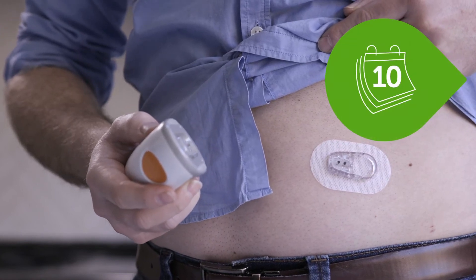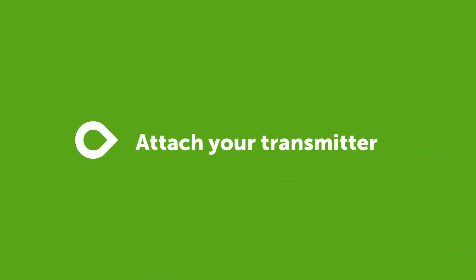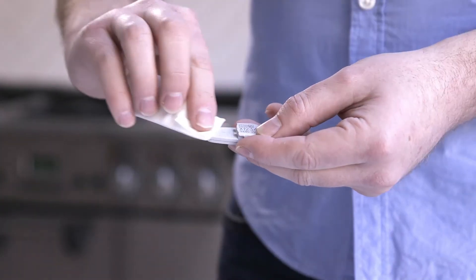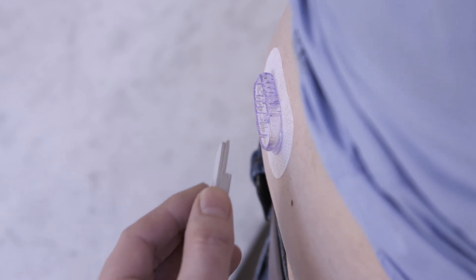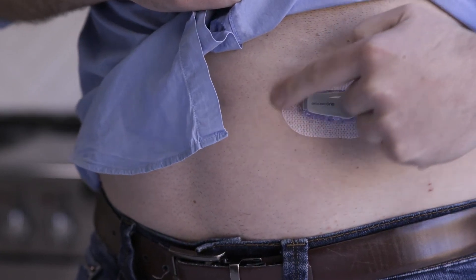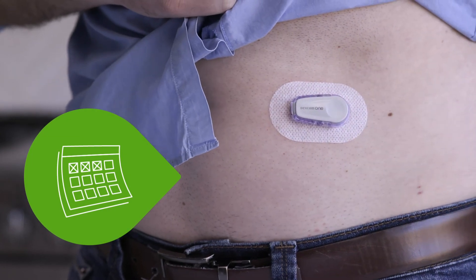Your sensor will last for up to 10 days. Now it's time to attach your transmitter. Clean your transmitter with an alcohol wipe and let it dry. Insert the transmitter tab first into the holder. Click the transmitter firmly into place. Rub around the patch three times. The transmitter is now attached. You'll reuse this same transmitter for three months.